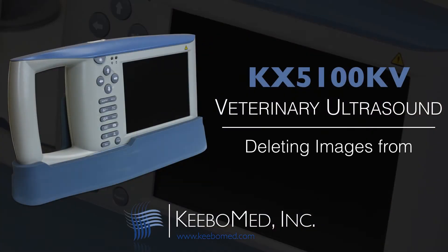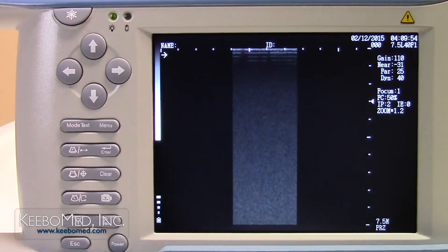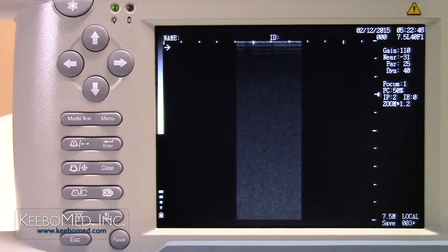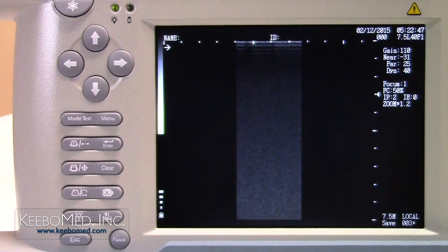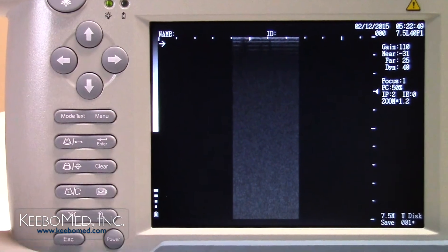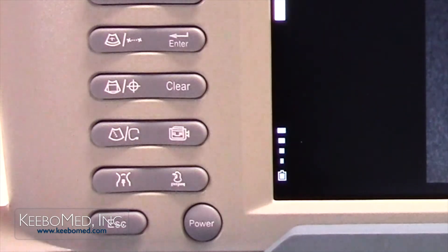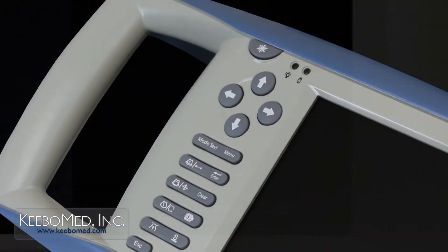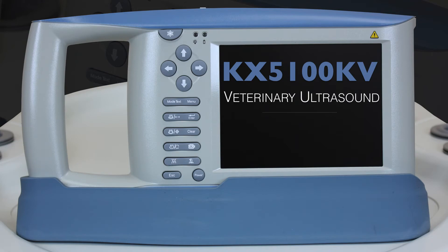To delete images directly from the USB drive, follow these steps. Step 1. Press the freeze key to freeze the image. The letters FRZ will appear on the bottom right corner of the screen. Step 2. Press the save key to recall the saved images on the system. Local will be displayed on the bottom right corner of the screen. Step 3. To switch from the local drive to the USB drive, press the mode key. U-disk will now be displayed indicating that the USB drive is now active. Step 4. Once the proper image code is selected, press the delete key. The asterisk will disappear indicating that the image is now deleted. For more information or to purchase the KX-5100KV veterinary ultrasound, visit our website at kibomed.com.